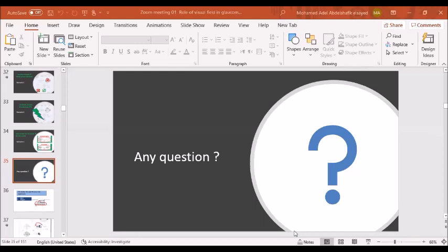Okay, so in early glaucoma, is it better to do the 10 degrees also besides the 24? It's not agreed upon as a routine, but if you have software that can check the central area more, that will be better. In the Octopus, the distance between one tested location and the other in the central area is 2.8 degrees. This is better. If you are still using the Humphrey, I go for the central 10 if there are changes in the OCT. But up till now, there is no agreement to use the central 10 as a routine in every case of early glaucoma. Maybe in the future, this will be part of the management.